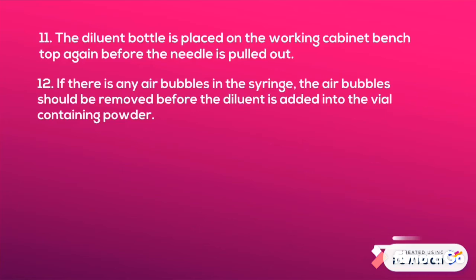If there are any air bubbles in the syringe, the air bubbles should be removed before the diluent is added into the vial containing powder.